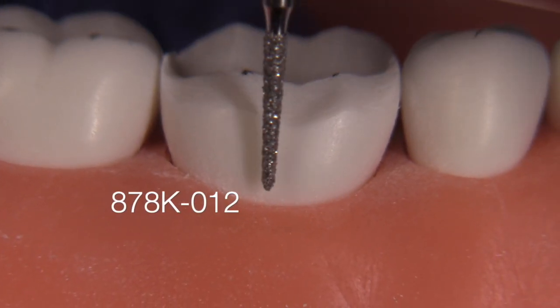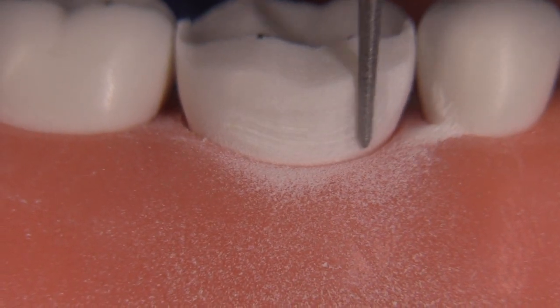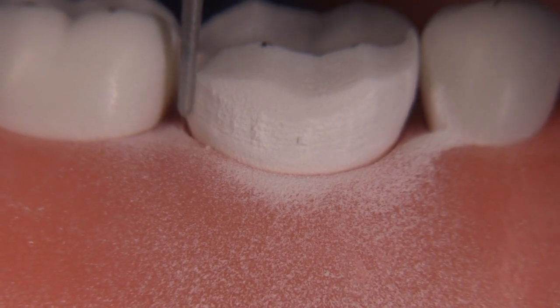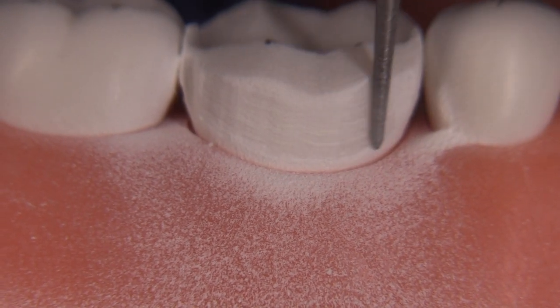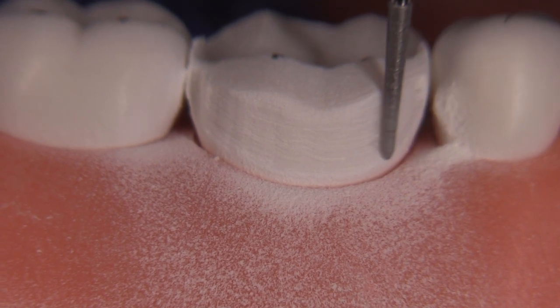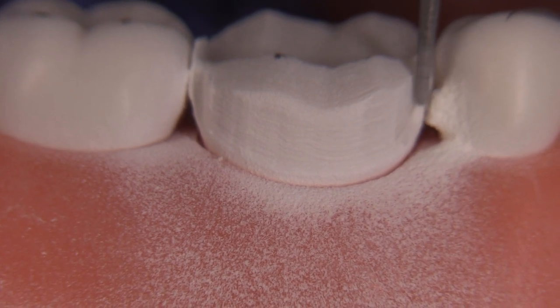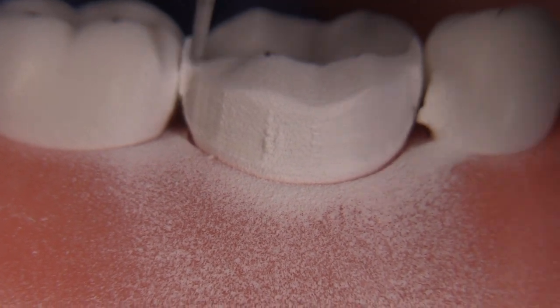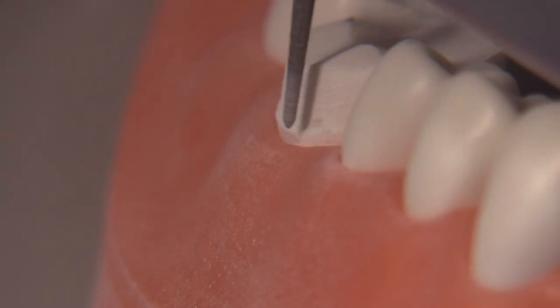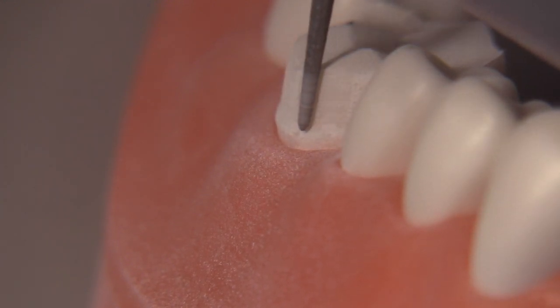For axial reduction I like to use the 878K012. It can make a chamfer for you, but the chamfer is going to be quite narrow — most of the time you want a chamfer that's closer to 0.5 to 0.7 millimeters in axial depth. This very skinny-tipped tapered diamond won't provide you with adequate chamfer depth. Remember, a chamfer has an angle that's at least 45 degrees downward towards the tissue — this provides that nicely but it's just a little on the narrow side.